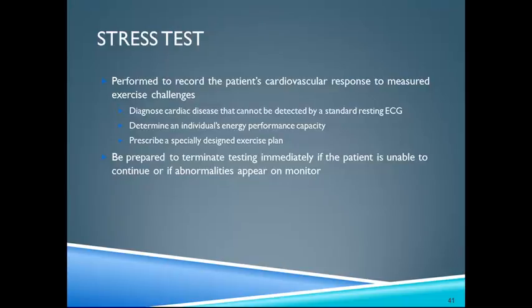And then what happens after we reach a certain exercise tolerance or that predicted heart rate, we will then do another set of images by echocardiogram. After those second set of images are done via nuclear medicine and echocardiogram, we then compare the resting prior to versus post exercise and see if there is any differences or lack of oxygen being supplied to the heart muscle.